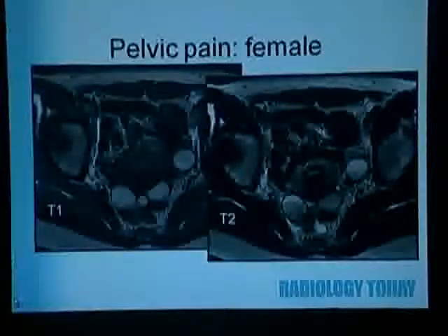Now here's the use of MRI in a more complex case. This patient had bilateral adnexal masses. Some of these were felt to be intraovarian, even within a very posteriorly located right ovary. But on a 6-week follow-up, which was appropriate to evaluate whether these were hemorrhagic cysts in this premenopausal female, they did not resolve. In fact, a subsequent follow-up was obtained, and they also did not resolve.